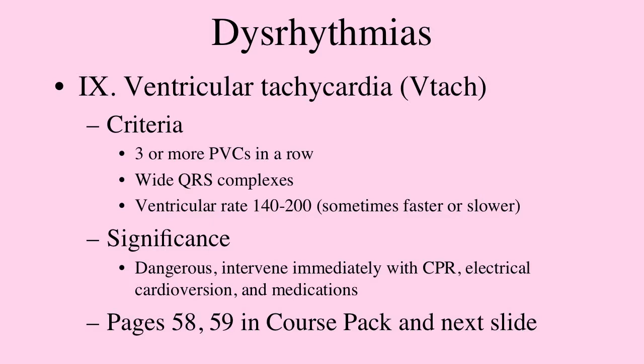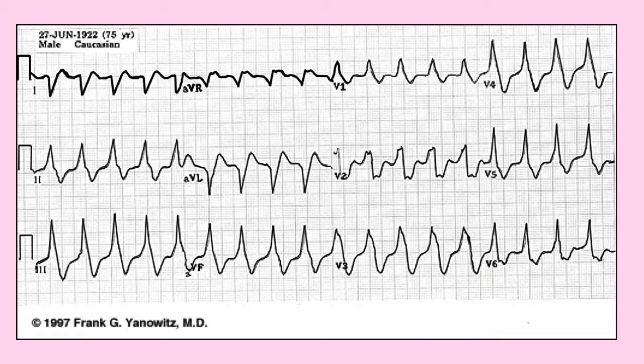The good thing about it, there's really nothing good, but a good thing about it is that it's fairly easy to see. But it is a bad dysrhythmia, and if you work clinically, you'll really learn to respect this and treat it, and treat the patient, and work on getting them out of this with initially CPR, which doesn't get them out, but kind of sustains them until you can convert them electrically or give medications to convert them.